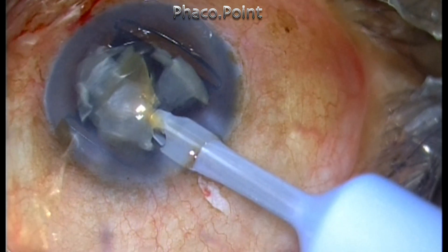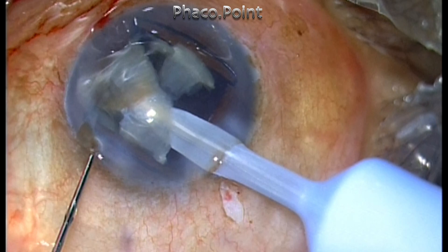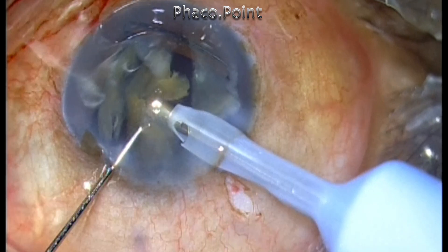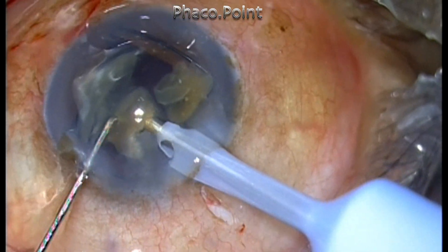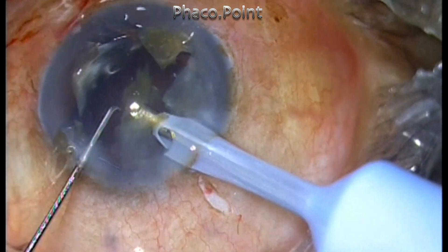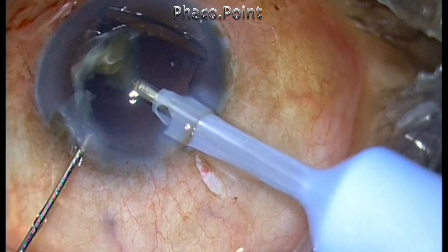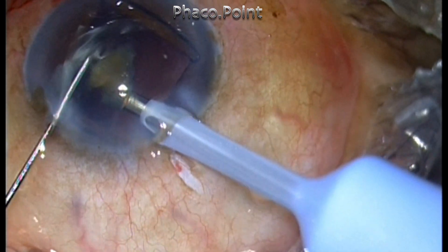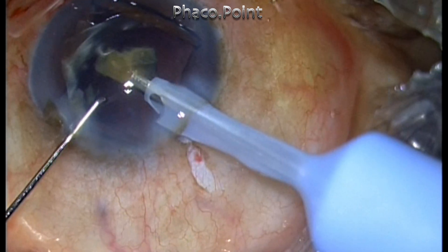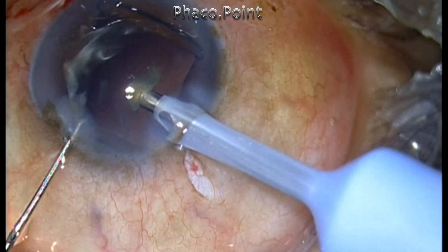At this point you have to be very careful because you're working with pretty high vacuum. The shallow chamber is quite evident as the second instrument cannot get in easily. While removing the last piece, reduce the vacuum from about 350 to 250 mmHg and also reduce the power to about half of what you've set.